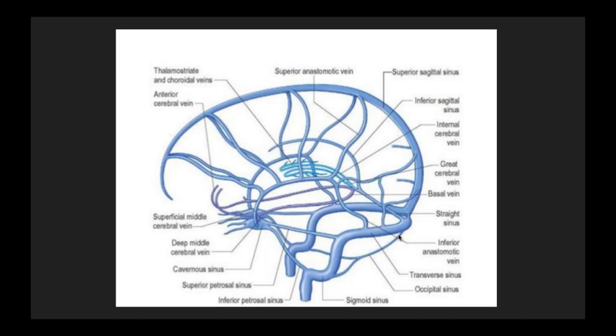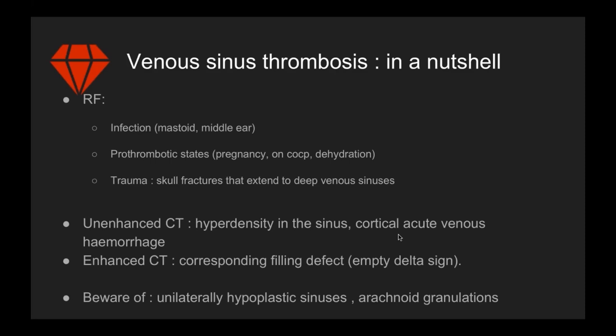I would definitely recommend that you just familiarize yourself with the anatomy of the venous sinus thromboses before you go on call. It will just get you out of a sticky spot when you're on call. So again, just a few pointers about venous sinus thromboses.